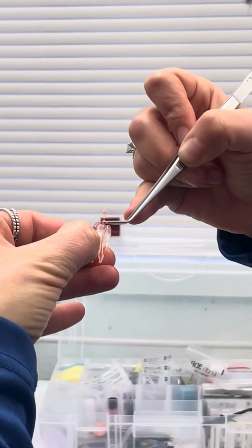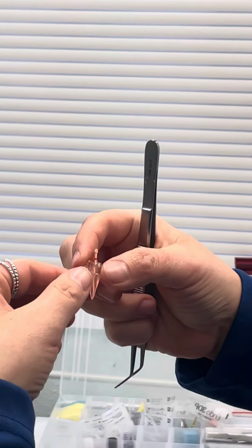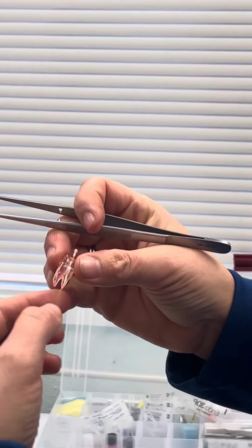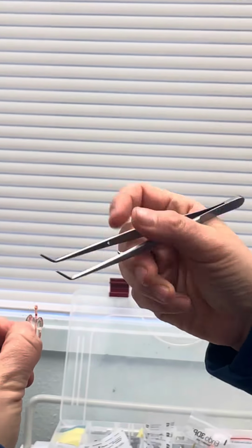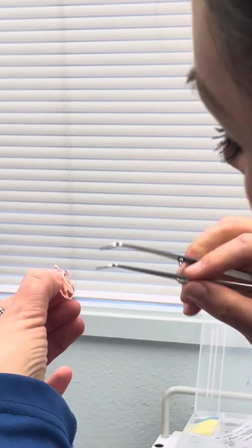And for me, currently, I'm going past the apex, right? Because I let my file go way out of there. Okay, now what do I do? How do I mitigate through this? Well, you could do the one thing that I talked to you about. You can clip the tip at this point. And right here, we have our full shaping still matching. We have good tug back, we're good there.